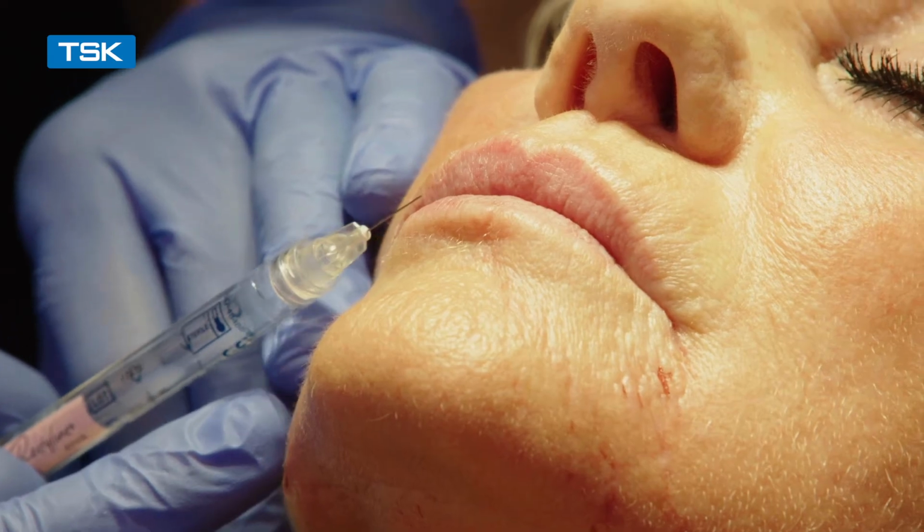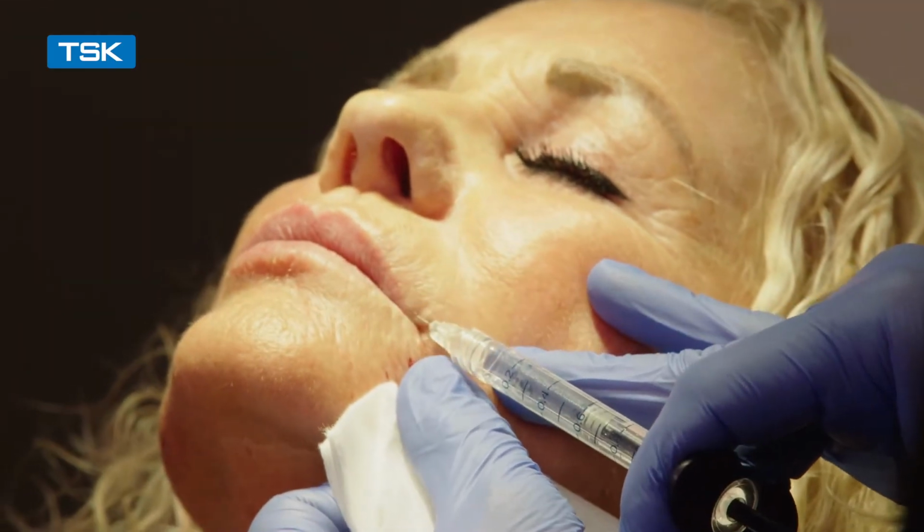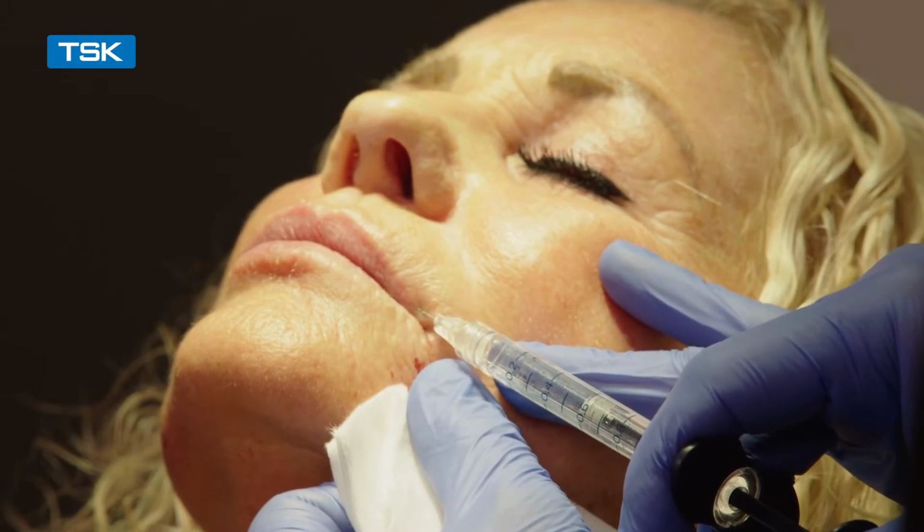Looking at the anatomy of the lip, it's important to realize that the vermilion border is a very weak structure and the white roll is very strong. So if you want to elevate the white roll, if you want to project the white roll, it's important to hit the white roll with your needle and make little tent poles from the muscle or the fat, whichever tissue is in the lip, upwards to elevate the white roll and to make it sharp. If you go the other way, if you follow the white roll and you fill it, you have a blunt effect, which will give a very noticeable fake lip enhancement.